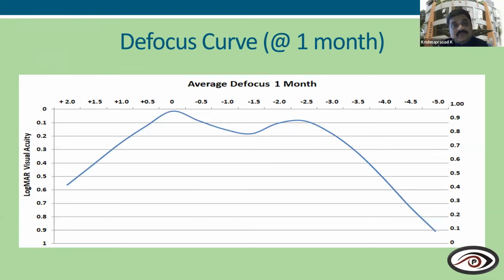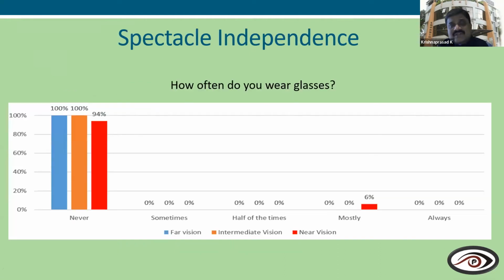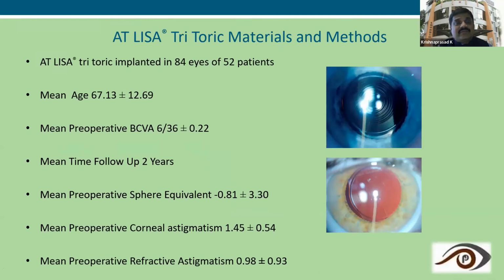Compared even to the EDOF lens, the defocus curve is pretty good here. If you take the patient complaints, how much did patients really complain of glare and halos? It's only bothering around 5% of patients, but 70% of patients are really happy, with no glare and halo. Only 6% of patients really required glasses for very fine print.